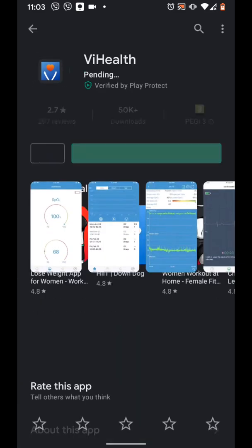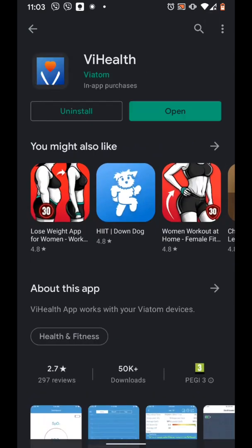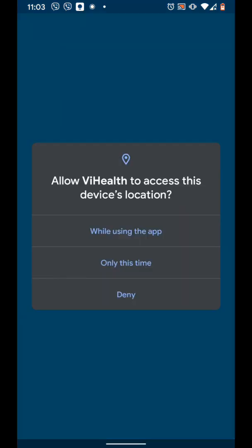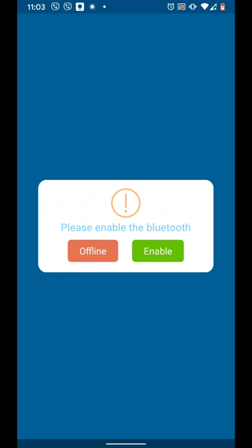Then tap Install. It will take a few seconds for the app to be installed. Once installed, open the app. Tap I Agree, then OK. Now allow the app to access your device's location. You will also need to allow the app to access your media files. Then enable Bluetooth and tap Allow.